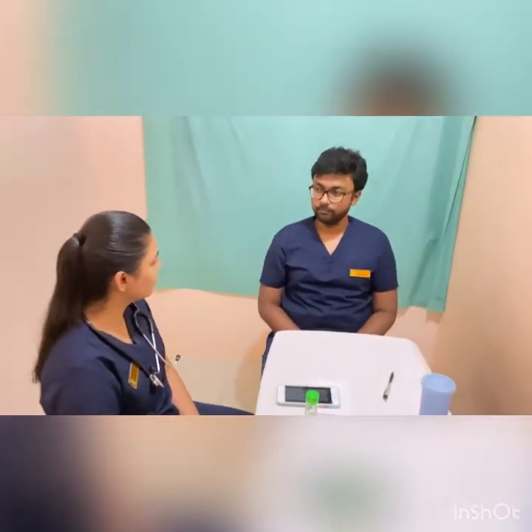So Subhoji, you're here for your eye examination. Do you have any irritation on your eyes? No, I'm here for a routine checkup. Okay, so we'll begin your routine checkup with visual acuity. Is that okay? Yes.